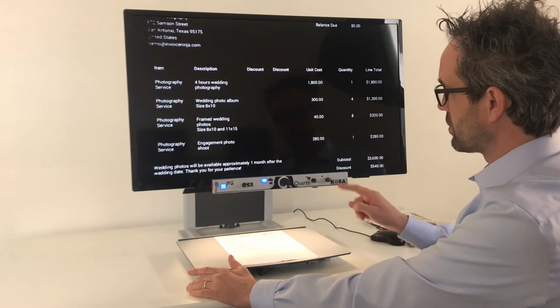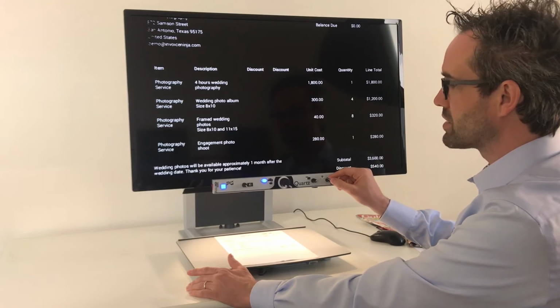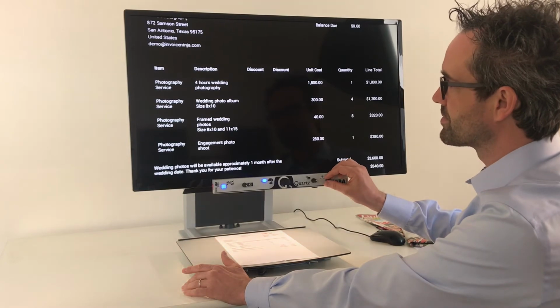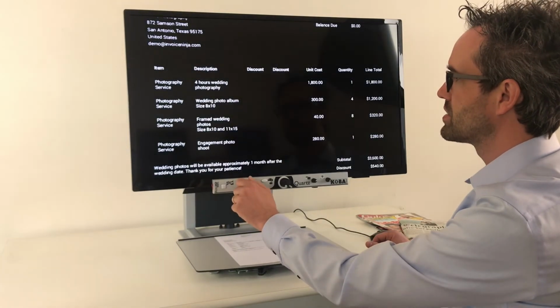Then on the right side, you also have a second tracking wheel. This is for changing the brightness of the lights on the sliding table. Reduce camera light, reduce camera light to minimum. Less background, change less here.